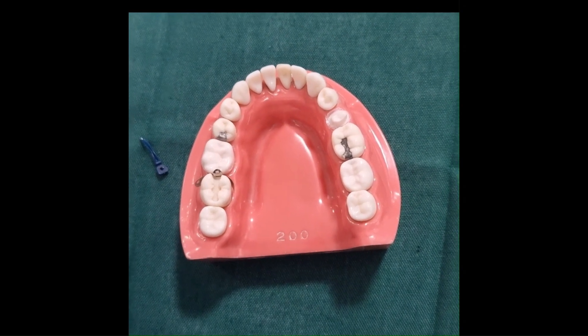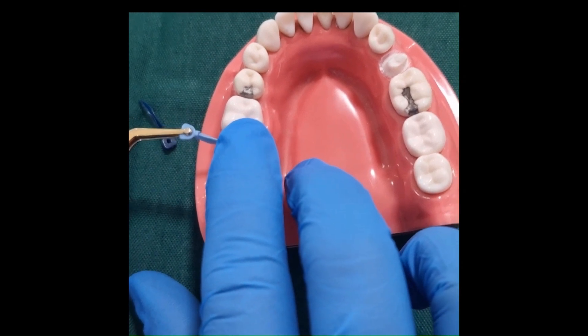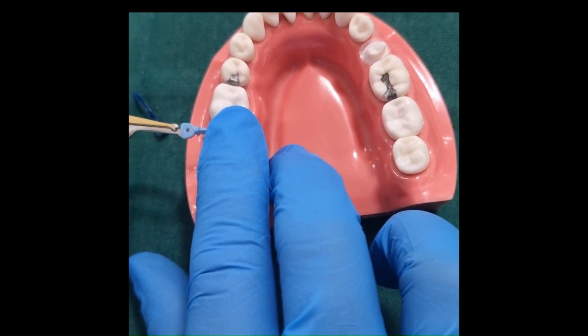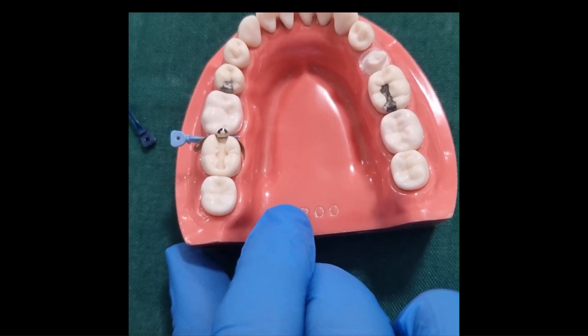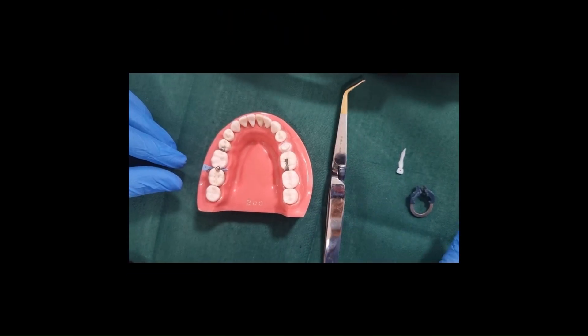Then the wave-shaped wedge, which is anatomically shaped, can be placed using the pin tweezer to stabilize the band in place. During wedge placement, use a finger to secure the matrix in place.